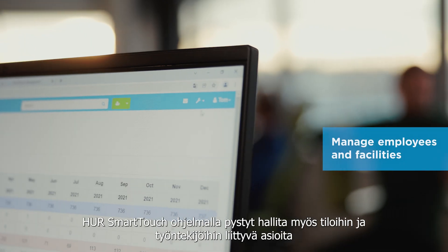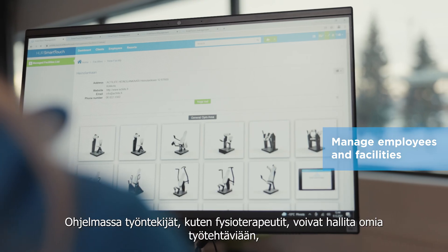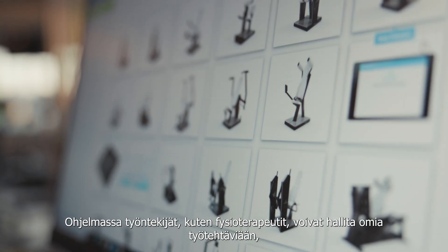With HUR SmartTouch you can also manage your employees and facilities. Employees themselves can manage their work in their own dashboard, see upcoming classes and follow their own customers' exercise and progress.